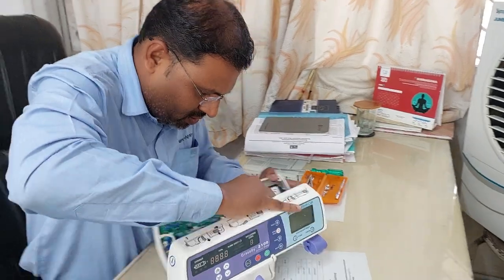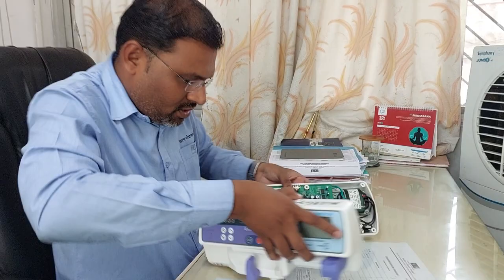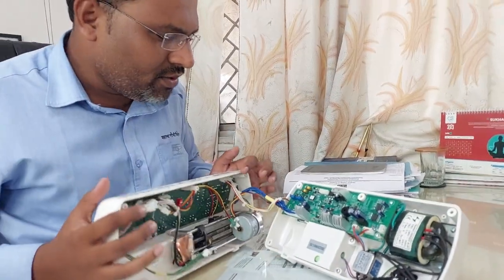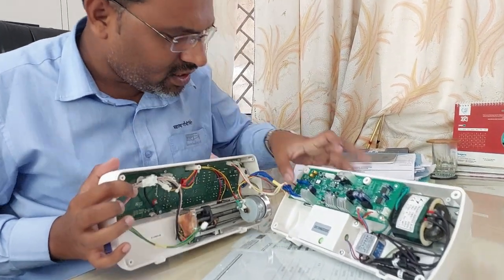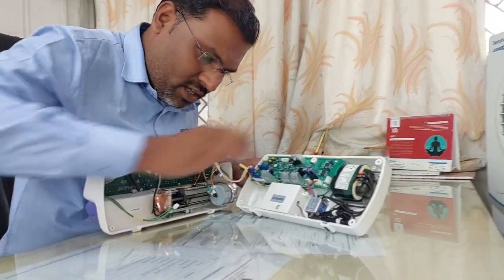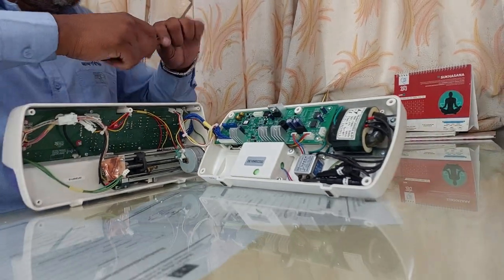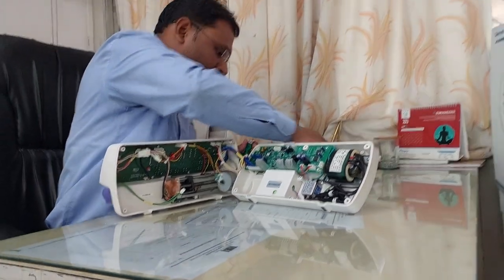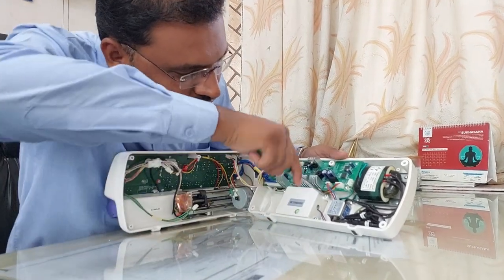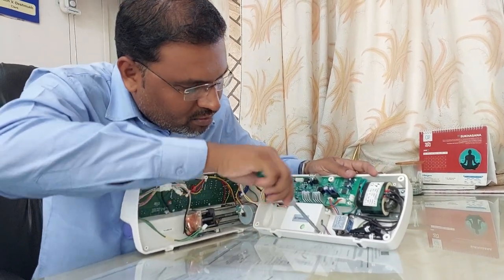Then what you have to do is just remove this switch. You can observe your battery is present in this box. If you don't remove this connector, that's also okay — no issue. You can observe the battery in this compartment. They have provided three screws to it. Use a plus screwdriver, and with this plus screwdriver you can remove the battery.